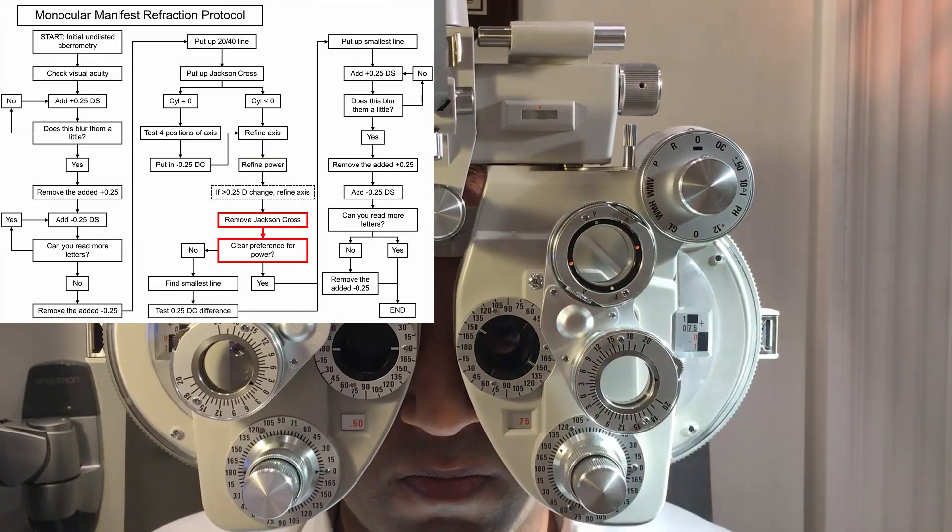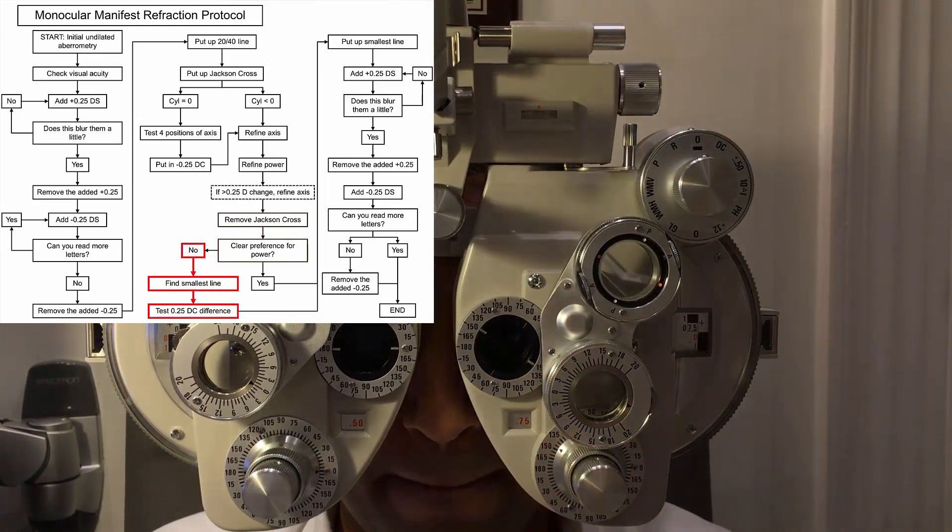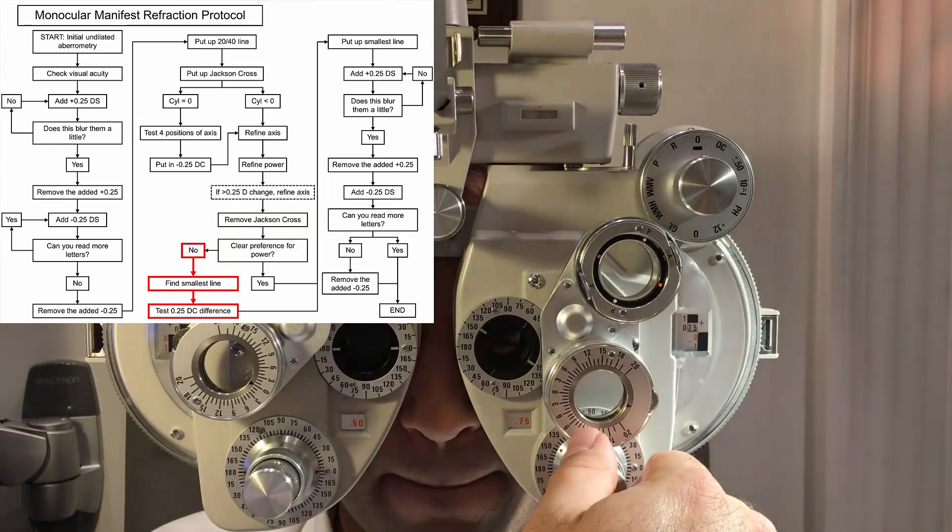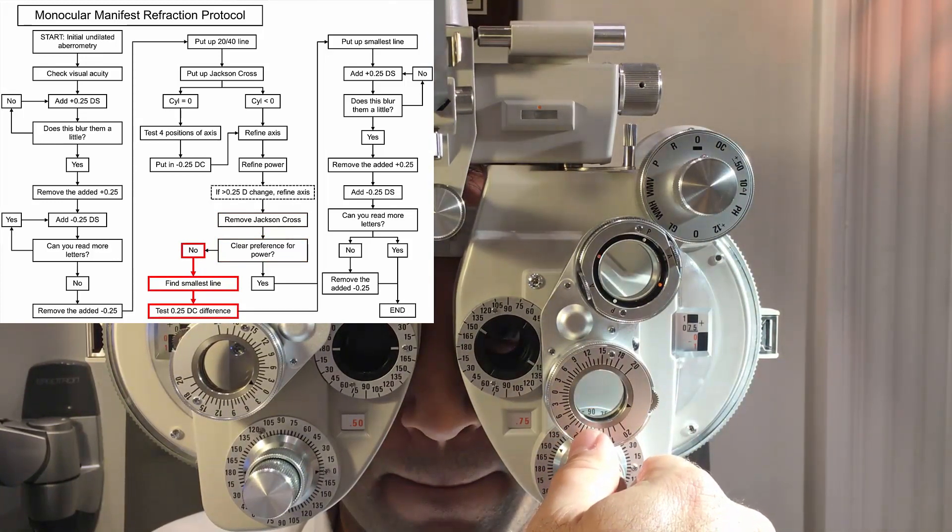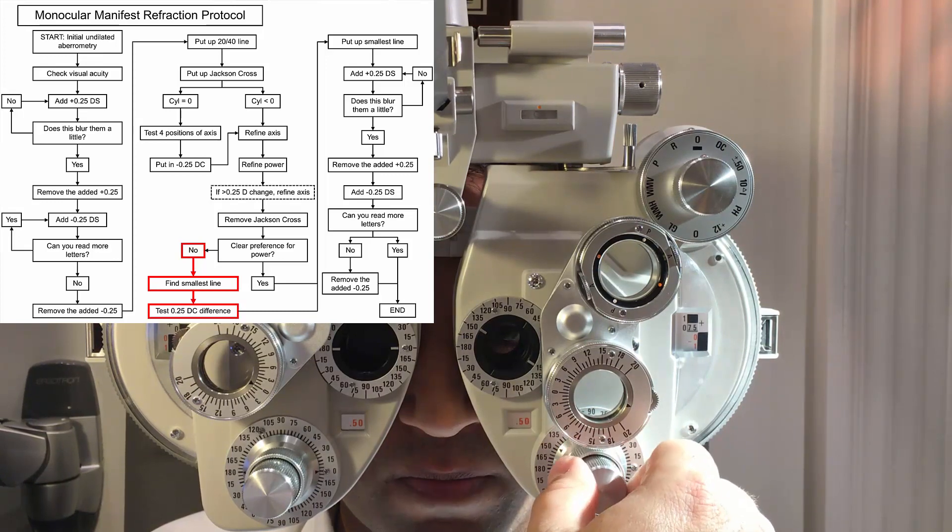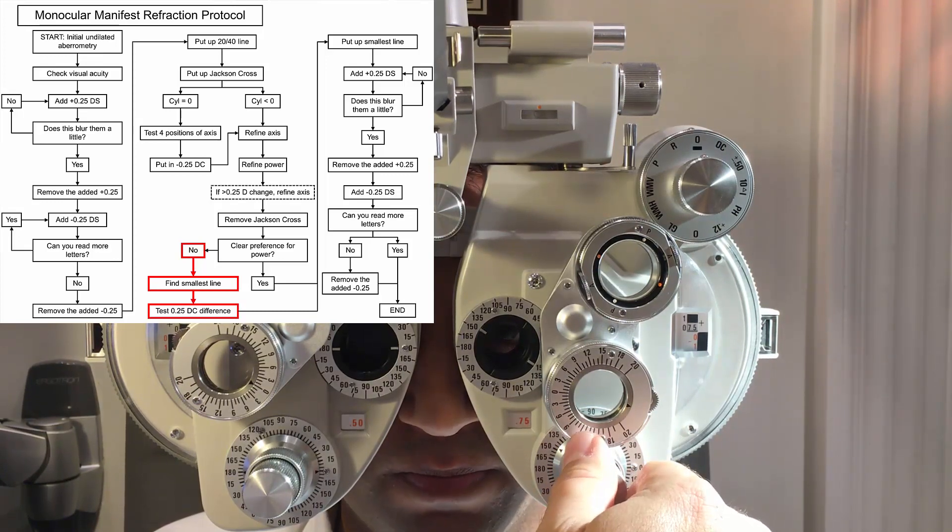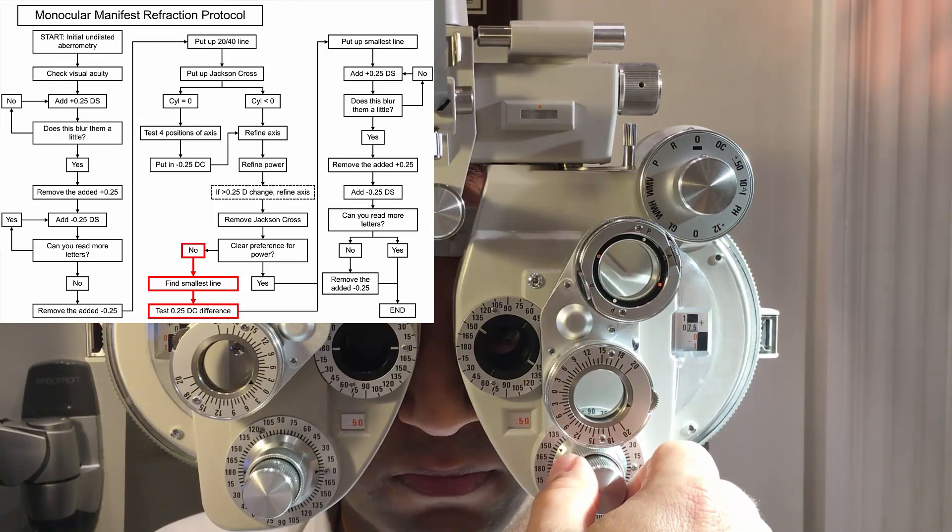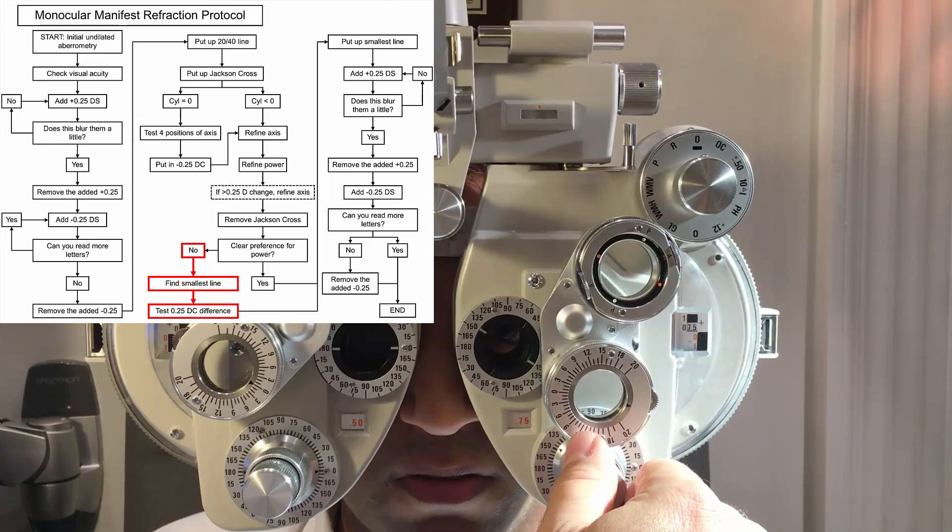And looking at the small ones, better one or two? One, two. Similar. One, two. If you had to choose. One, two. One, two. Slightly better on one? Yeah. Okay.